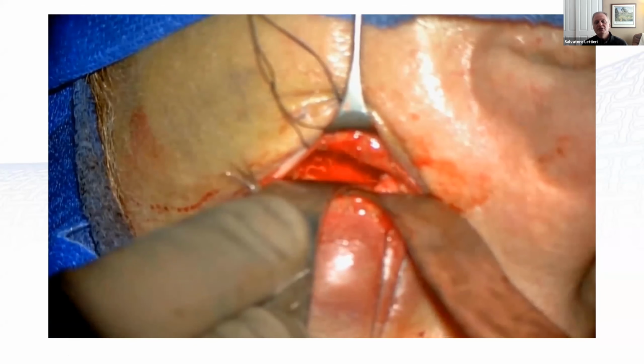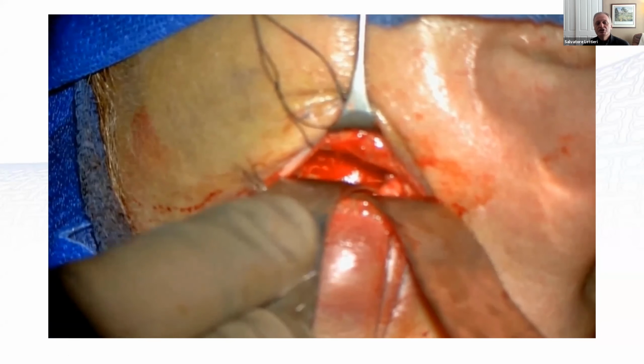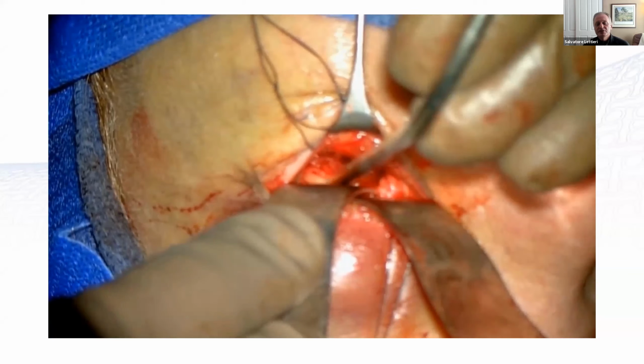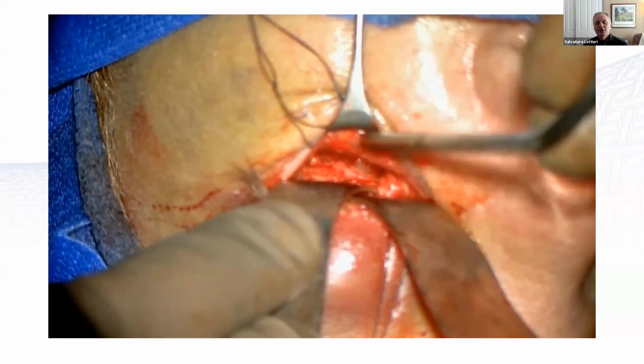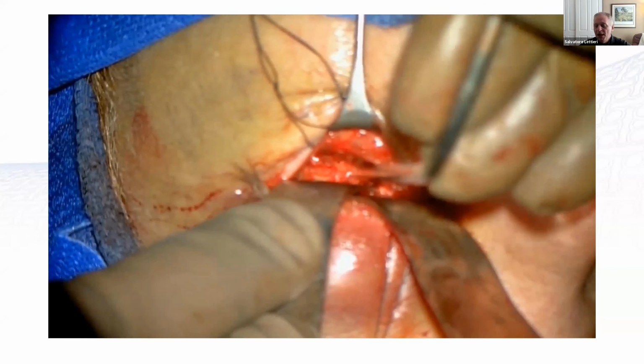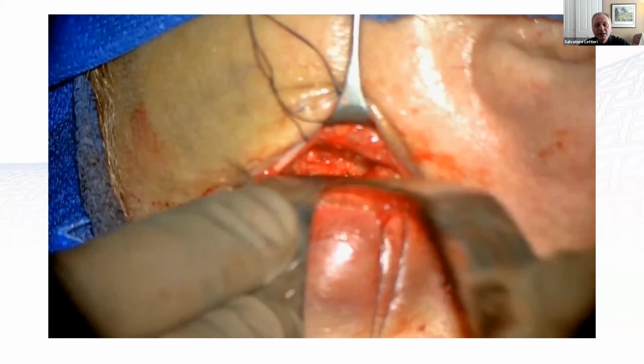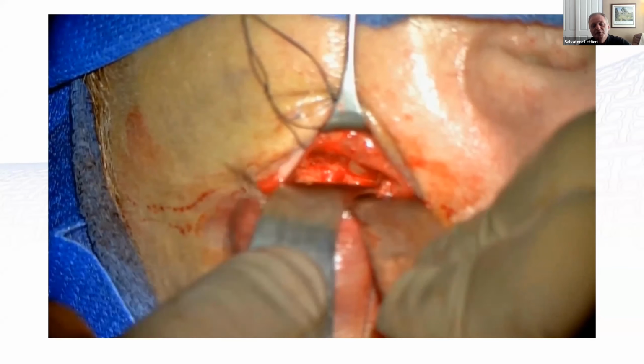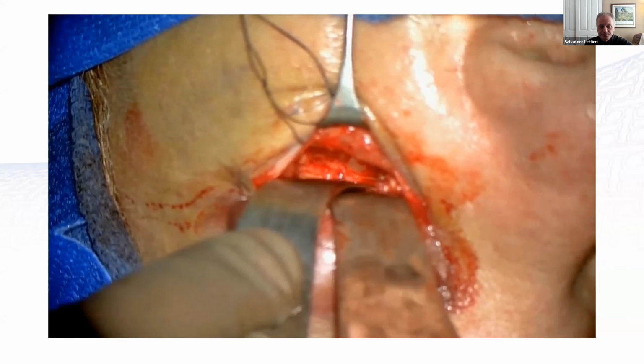And then this plate, when you put it in, should just rest. You should not feel any resistance. You should have everything reduced. And then when you lay the plate in, it should just pop in. You shouldn't have to push anything. In fact, it should just rest right behind the inferior rim, and you'll see what I mean here.